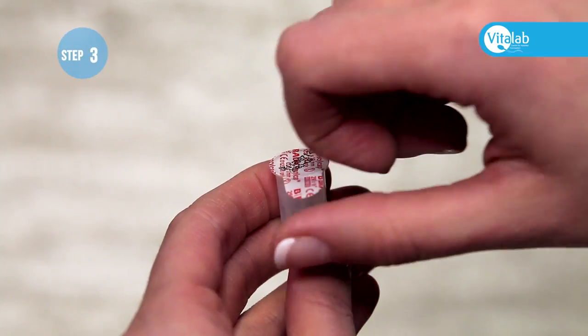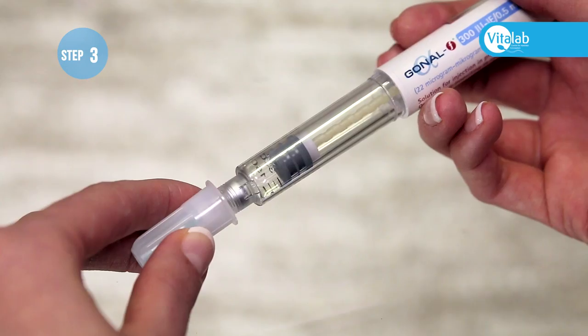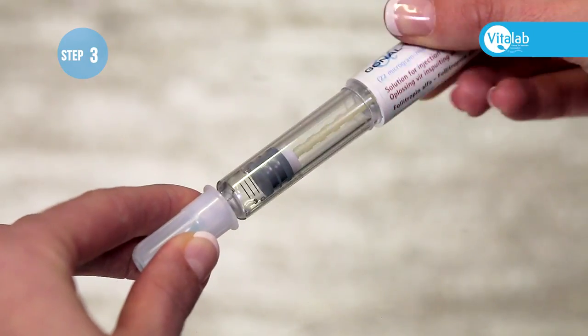Now remove the paper cover from the needle and screw the needle onto the pen until it fits firmly.